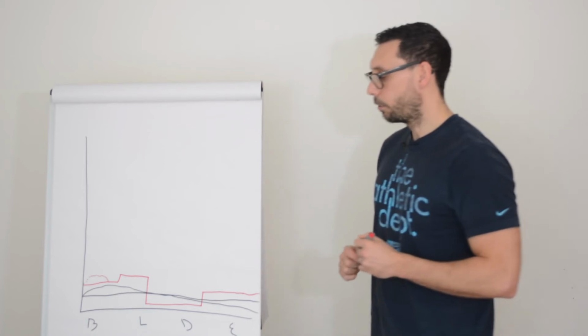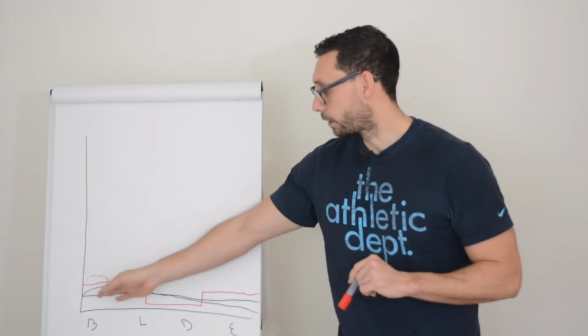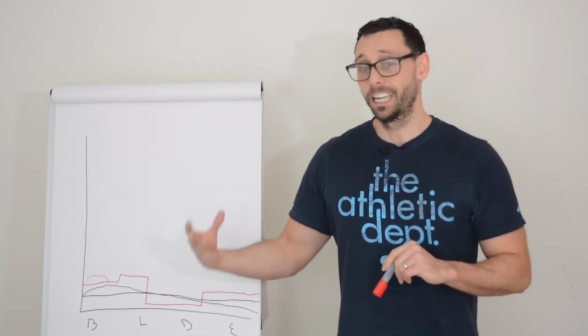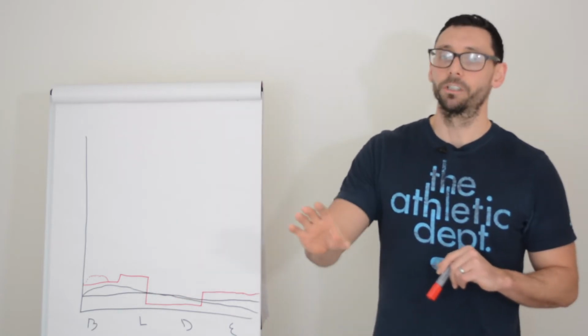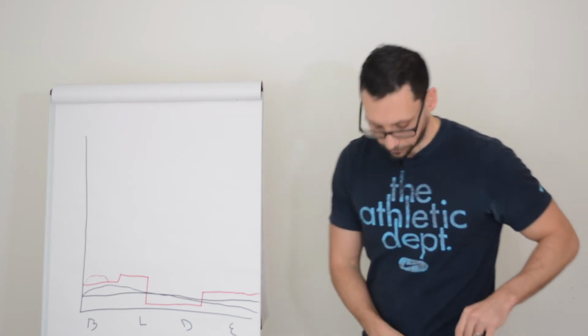So already we've got a lot more flexibility with that background insulin, because if you went for a run without using pump therapy, once you've injected that insulin, it's in. You can't turn it off. It's just going to do what it does. So then you have to manage your carbohydrate and your rapid insulin doses around that. More on that in later lessons. Whereas we can already see pump therapy gives you a lot more flexibility.